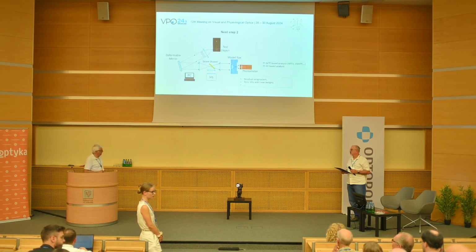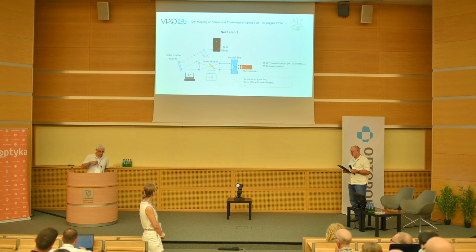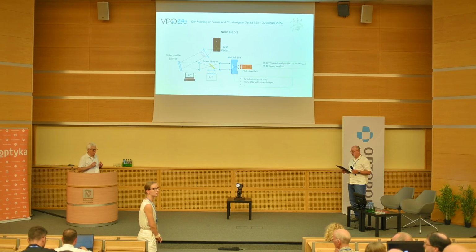Okay, well, when we have MTF-based analysis, we have the LSF and then the MTF. Yes, this same normalization factor could also be used with MTF-based analysis.